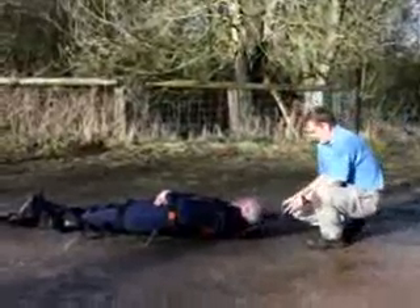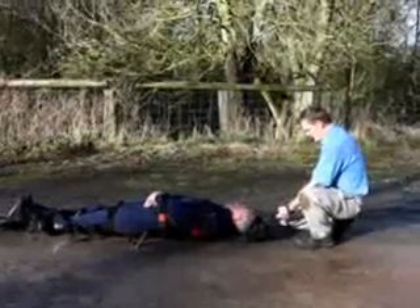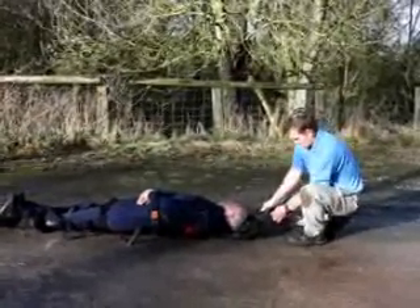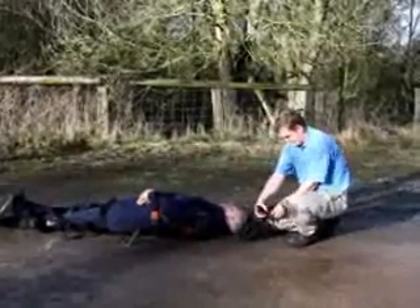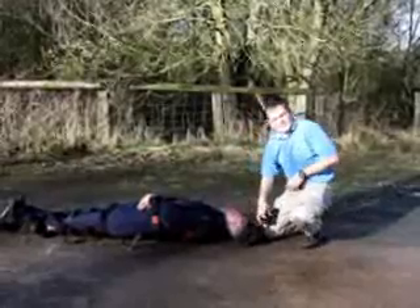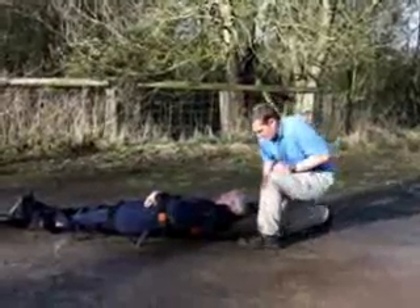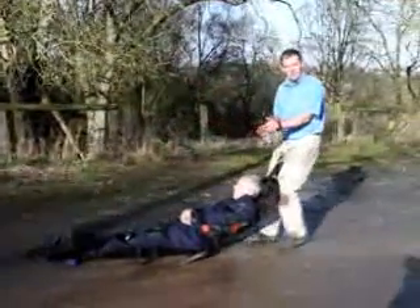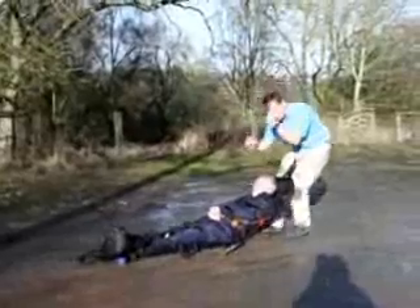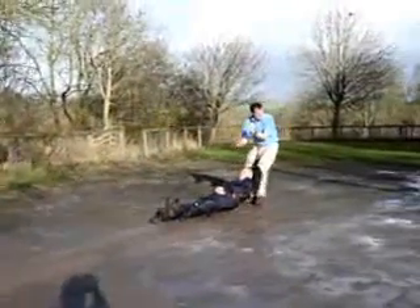The straps at the top and bottom also have loops that we can attach a carabiner through. So if you're used to wearing a rigger belt, you can potentially clip it into the belt, freeing your hands, and potentially you can either have a weapon or a ballistic shield to cover the casualty and the rescuer as well.